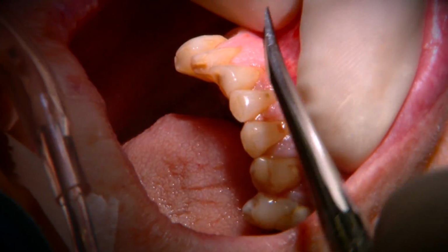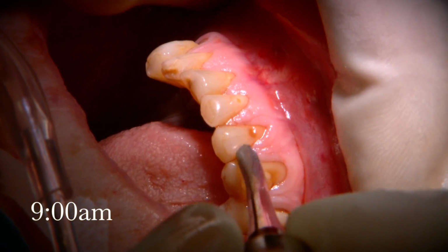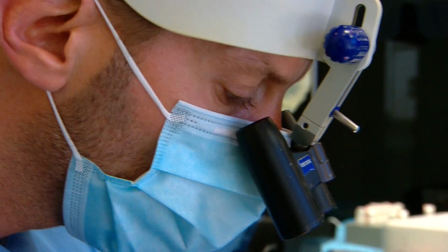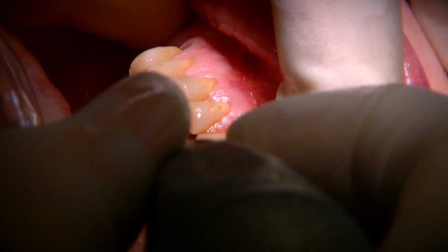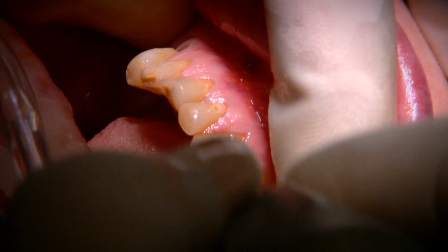So the very first stage of an all-on-4 procedure, you can have a look at these teeth. They're heavily filled. They're all obviously these white plastic fillings, because these small teeth are doing all the work at the moment because there are no back teeth. These small fillings are failing and fracturing and falling out. A couple of these teeth are dead and have infections at the end of them, and as you can see, there's just the aesthetic issue.